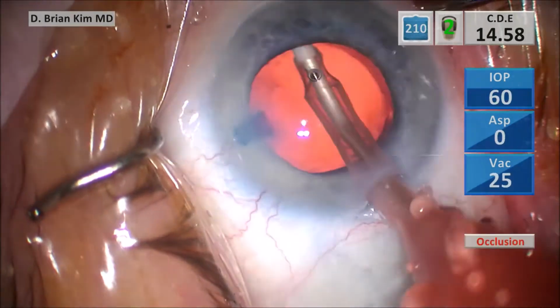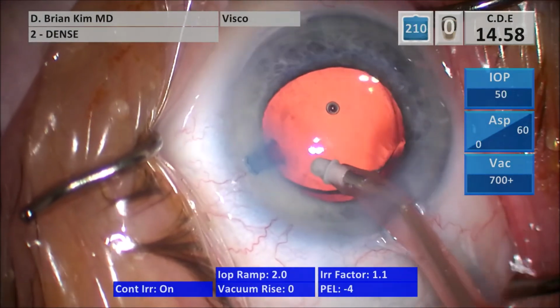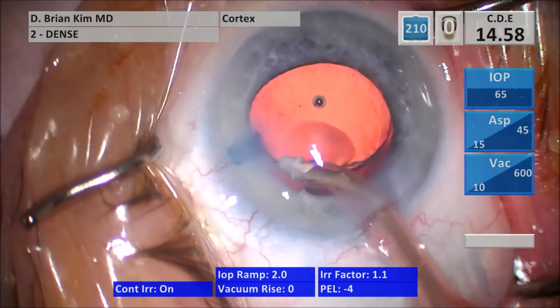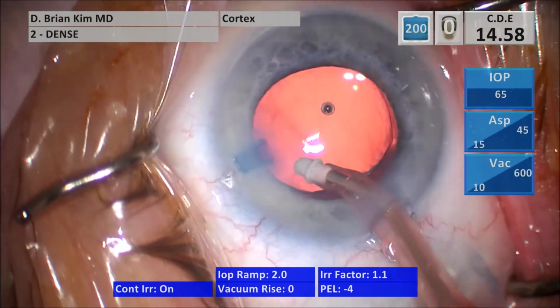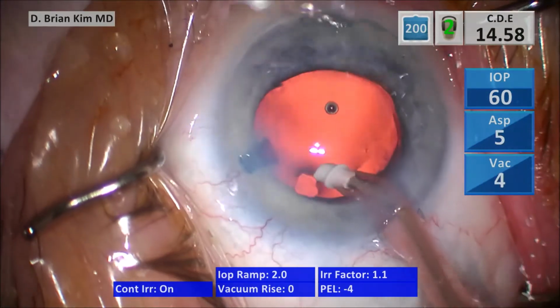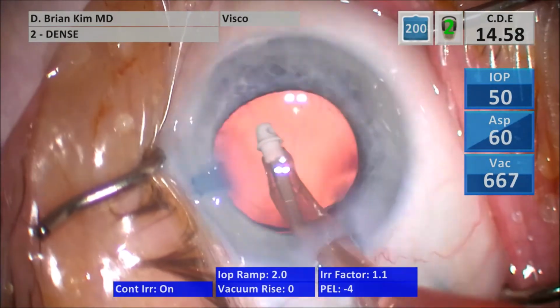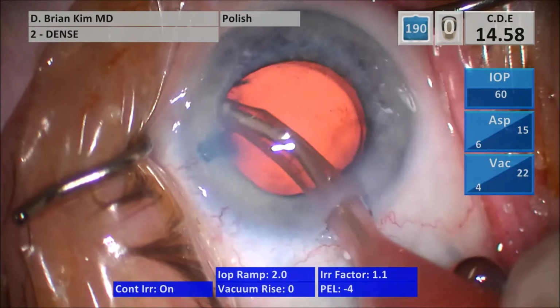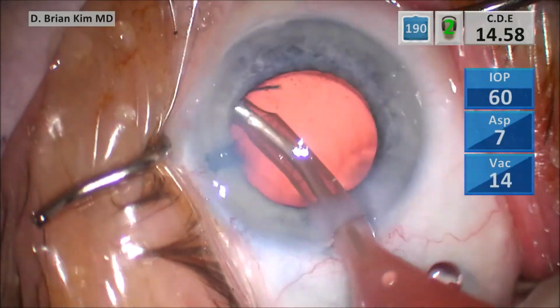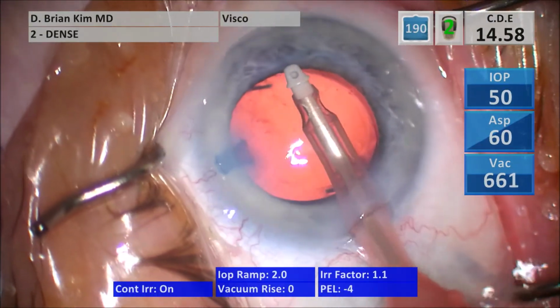There's some subincisional crud that's still stuck, so I switch to visco mode, removing that material. Since the lens is there, it also protects the posterior capsule. There's still some stubborn material, so I switch to polish mode and polish into the subincisional area once again. And then once it's free, I'm able to switch to visco mode, removing the lens material with that high vacuum. Again, I'm willing to do this in this context only because the lens implant is there and it protects the posterior capsule. Removing the viscoelastic from the anterior chamber, and then I'll hydrate my incision.